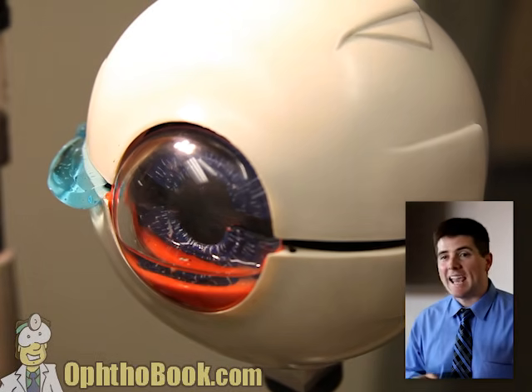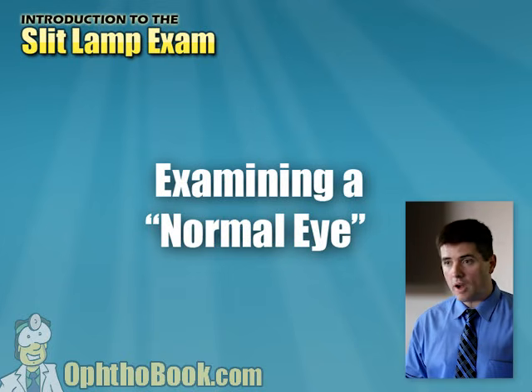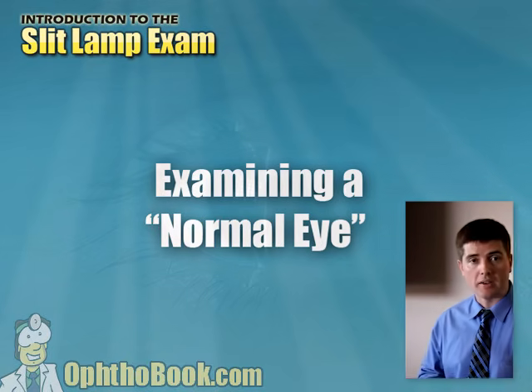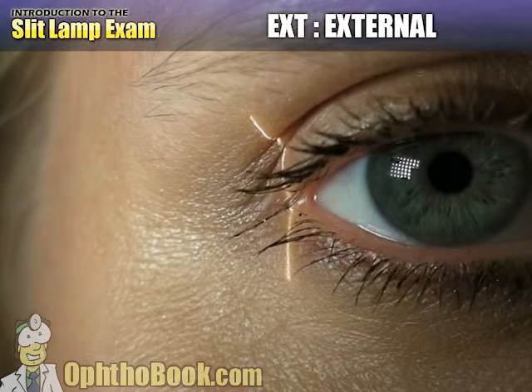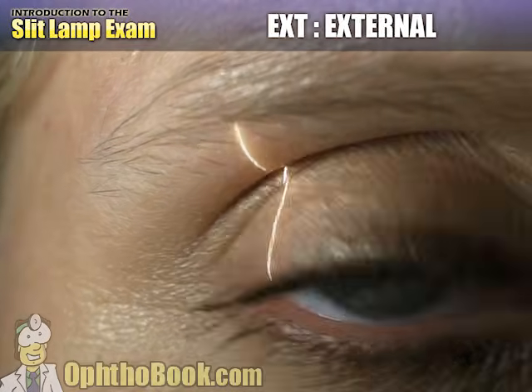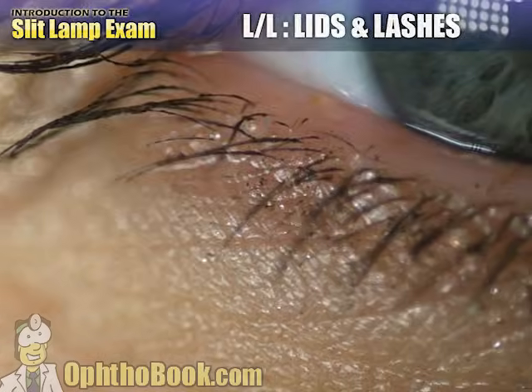Okay, so the 8 structures, el ocho, we've learned it on the eye model. Let's move on to a normal eye, and we'll repeat ourselves and see what normal looks like. Once again, we start with our external exam, looking around the eye. So we're going to look at the brow above, sweep across, we look at the nose, and looking down at the cheek, everything looks normal here.